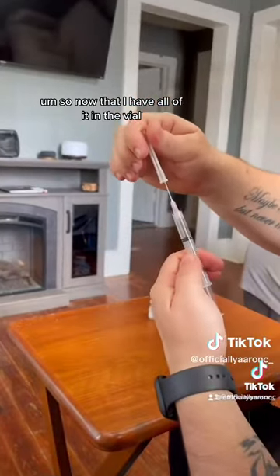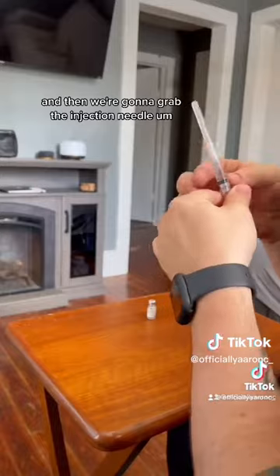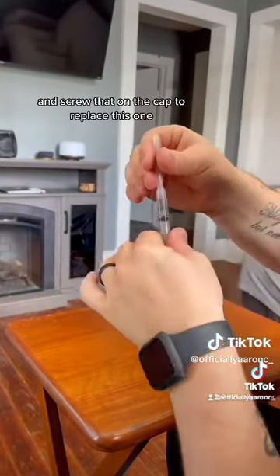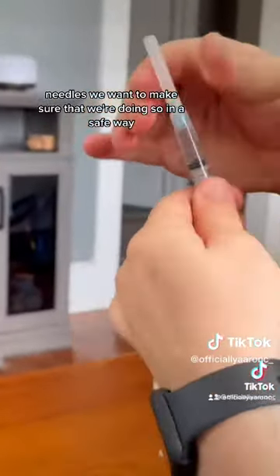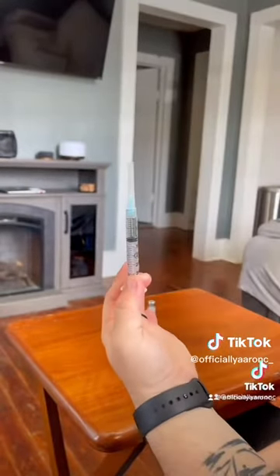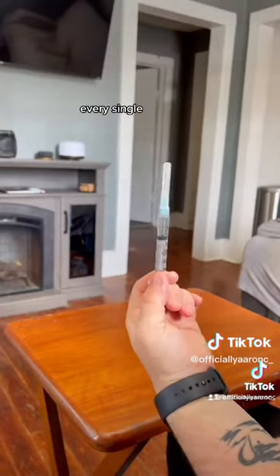Now that I have all of it in the syringe, I put the cap back on the draw needle, twist off the draw needle, and then grab the injection needle and screw that on to replace it. When discarding our needles we want to make sure we're doing so in a safe way — putting them in sharps containers. And this is how I prep my HRT shot every single week.